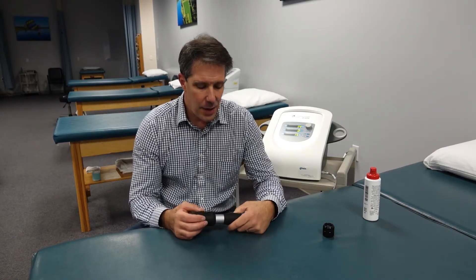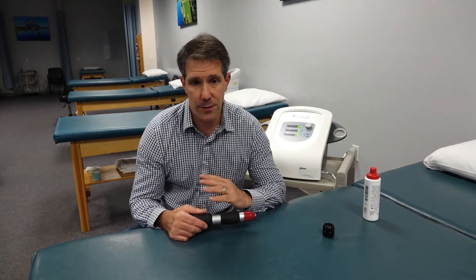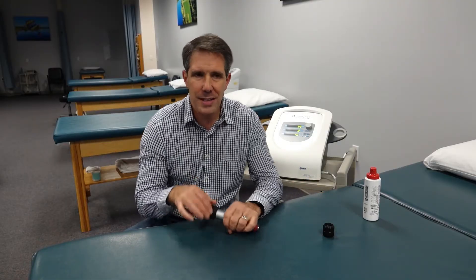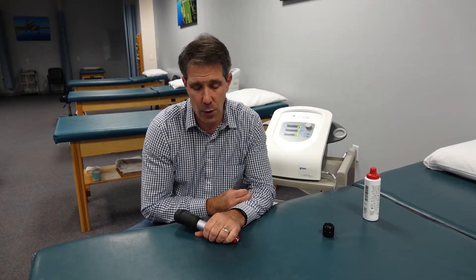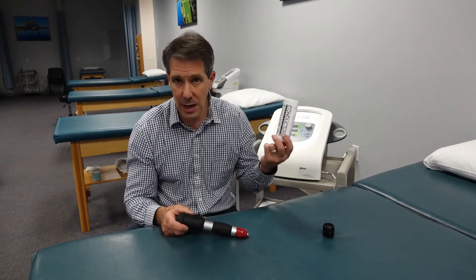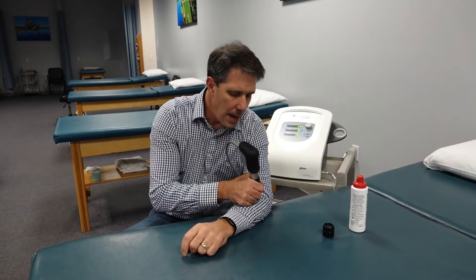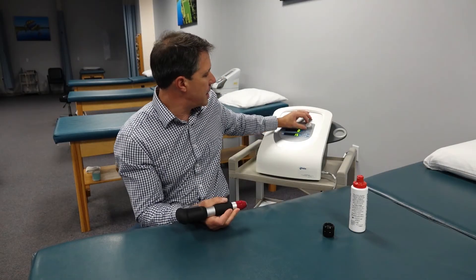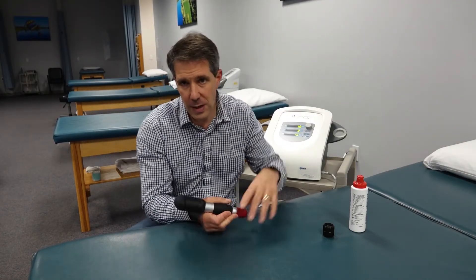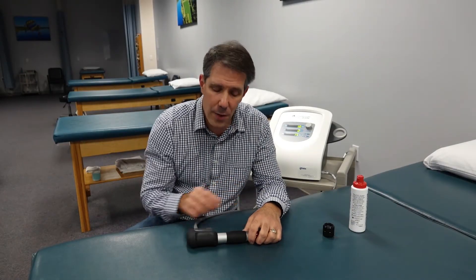Now if there is a con to this, it is a little uncomfortable during treatment — though some people find no discomfort whatsoever. There is a pulsating type of feeling, and you're looking for about a four to five over ten on a pain scale. You use a conductive gel on the skin, place the head directly on the area, and increase your intensity until they feel like they're getting that four to six on the pain scale, then continue with the treatment in that region.